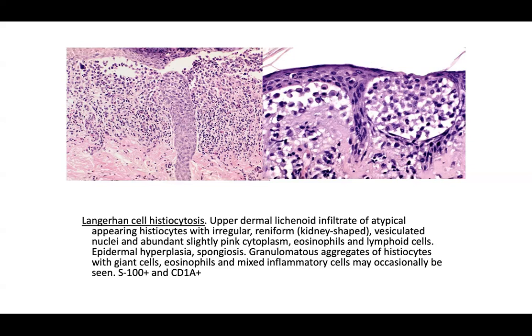This case represents Langerhans cell histiocytosis. On board exams they'll show H&E and expect you to get it by process of elimination. Classic features include: upper dermal lichenoid infiltrate of atypical histiocytes with irregular reniform or kidney-shaped vesiculated nuclei, abundant slightly pink cytoplasm, eosinophils, lymphoid cells, and epidermal hyperplasia with spongiosis. You need the clinical context as well.